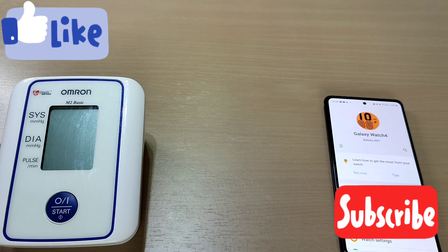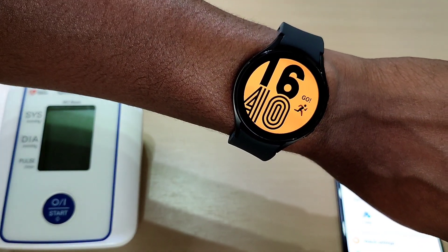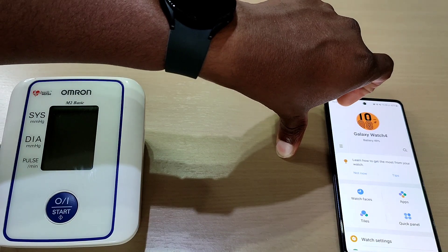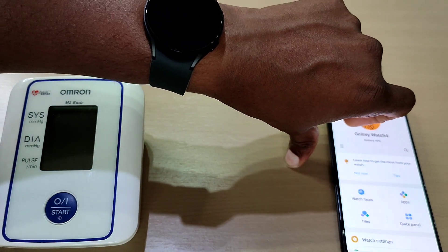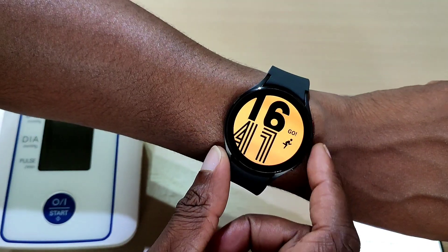Welcome back to another video. In this one we'll be checking out the blood pressure on the Galaxy Watch 4. To check ECG and blood pressure you need a Samsung phone. The watch itself will work with other Android phones, but you will miss out on the ECG and the blood pressure.